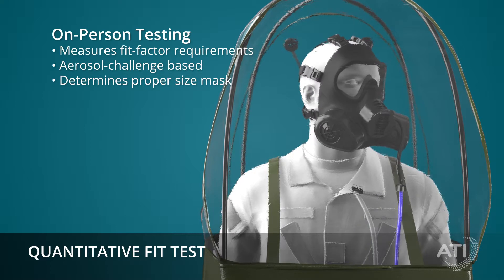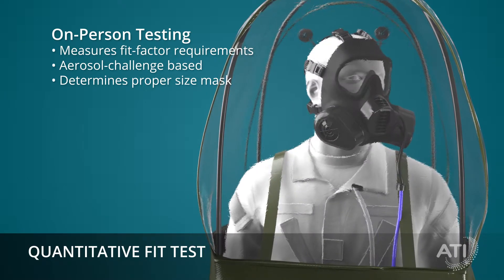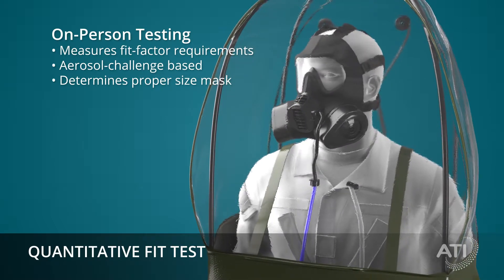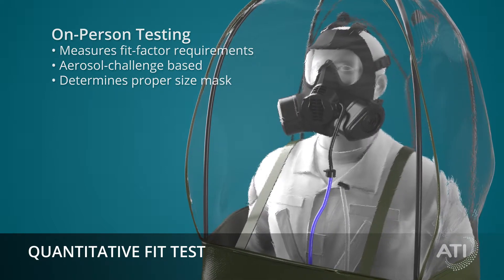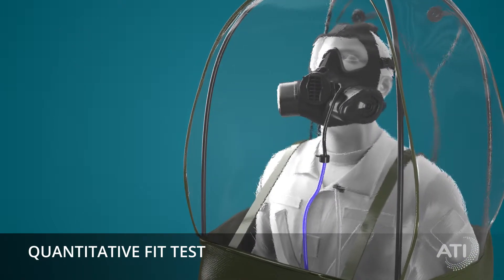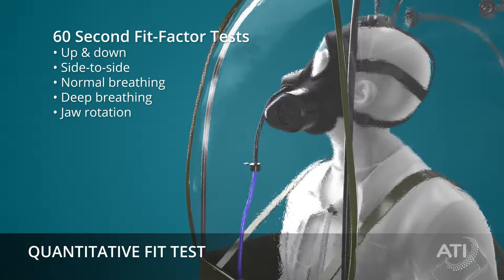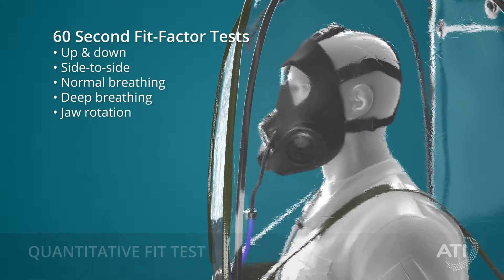The quantitative fit test measures the protective fit factor requirements while the mask is being worn by its end user. The aerosol challenge-based negative pressure fit test is used to assist personnel to determine if the proper size mask has been issued. There are five 60-second quantitative fit factor tests to assure real-world protection.